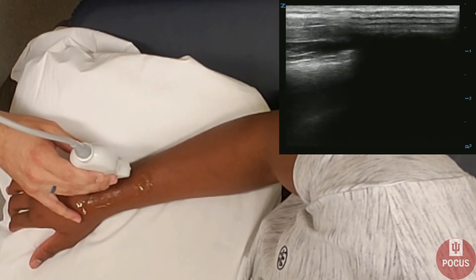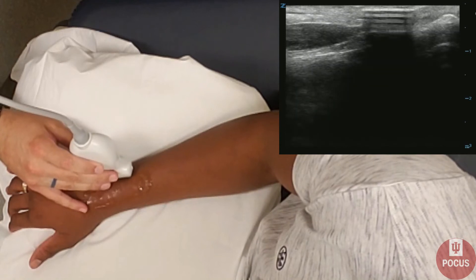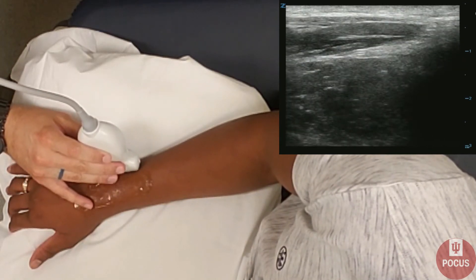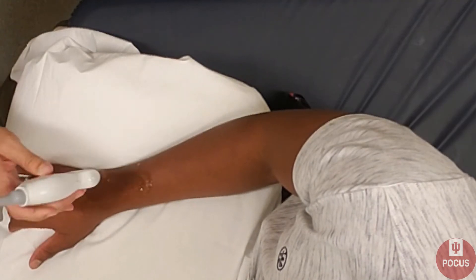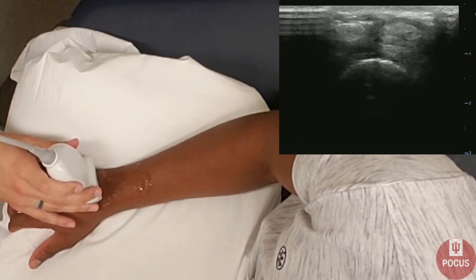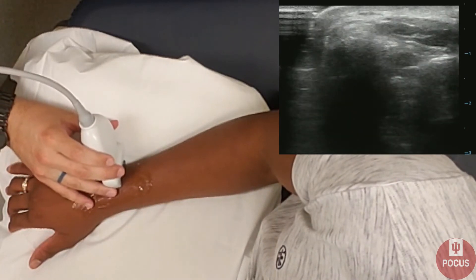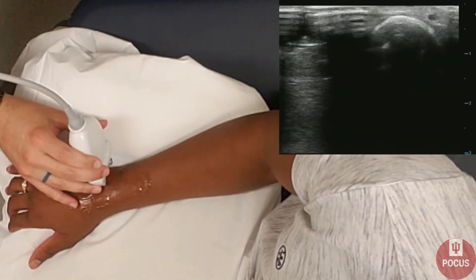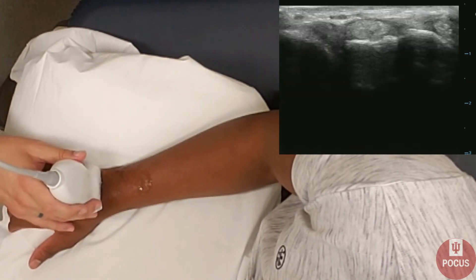Then we can look at the ulna in long axis for any signs of a fracture, which would be a cortical disruption. We can also rotate the probe 90 degrees and evaluate the ulna in short axis as well, again looking for any kind of disruption in the cortex.